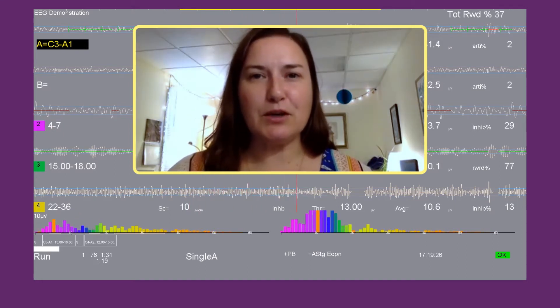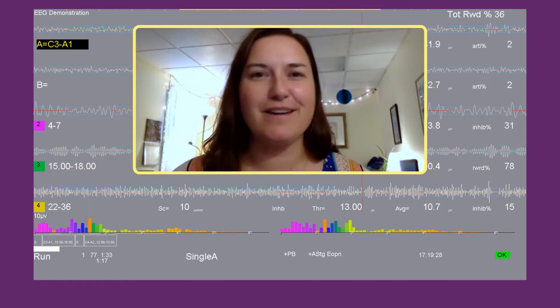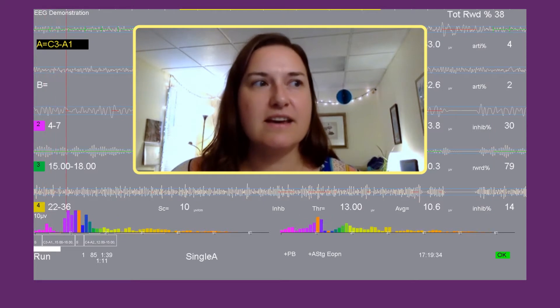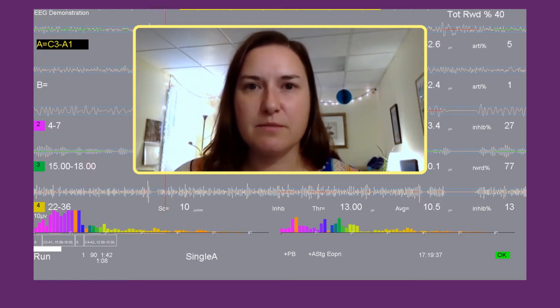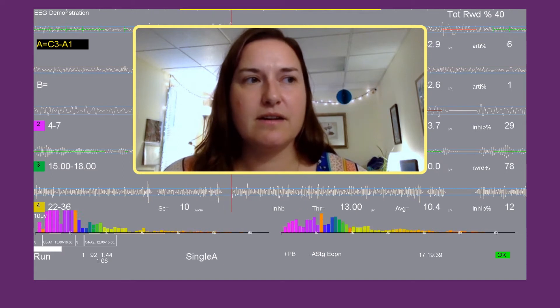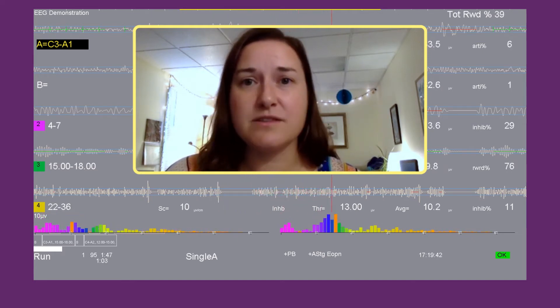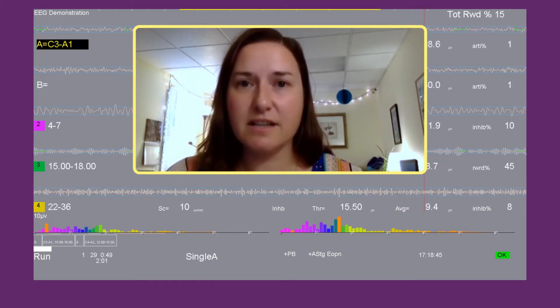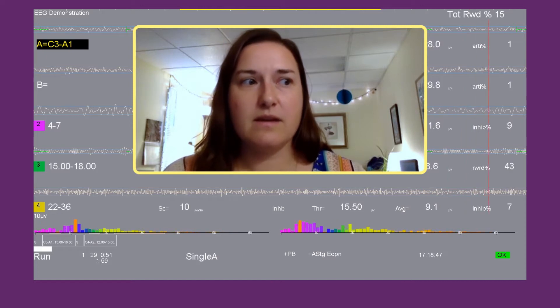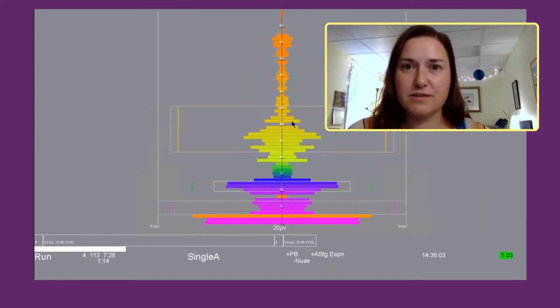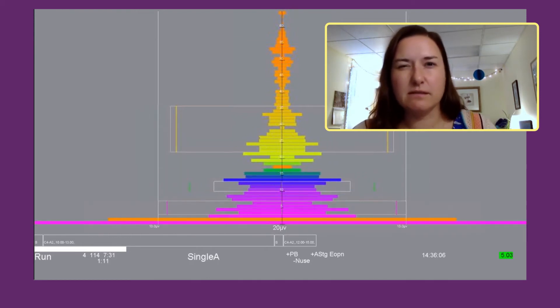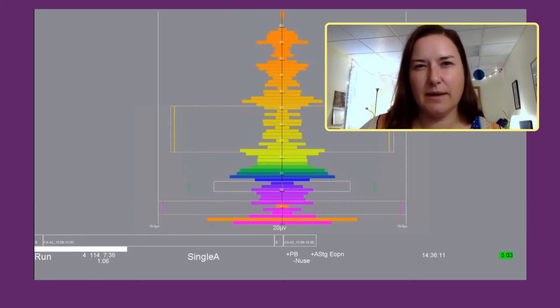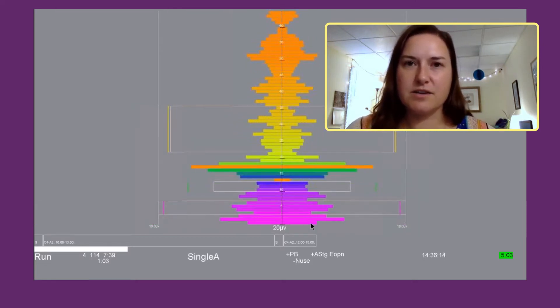Other than being this absolutely gorgeous pulsating bar of colors on the bottom of the therapist screen, the information the spectral provides is so helpful when it comes to establishing and determining any changes you might want to make in the inhibit bands or the reward bands for your protocols. The spectral at the bottom is a representation of each individual frequency as seen in the rainbow — so one hertz frequency is this deep purple, two hertz is a little lighter, and so on up to high beta, which looks like a yellowy color.